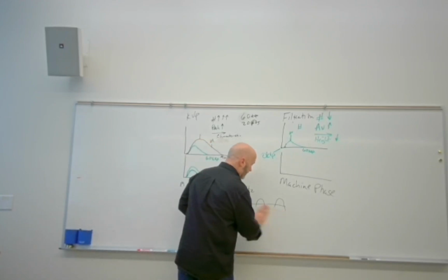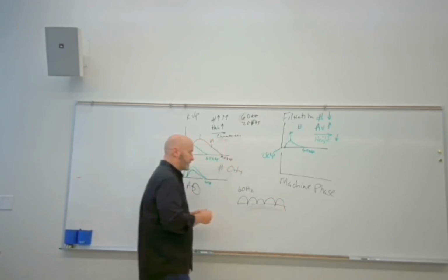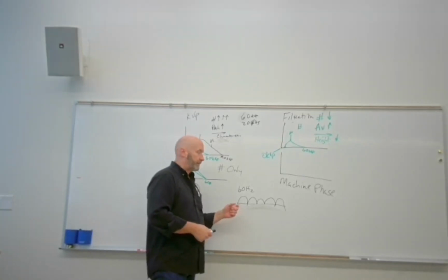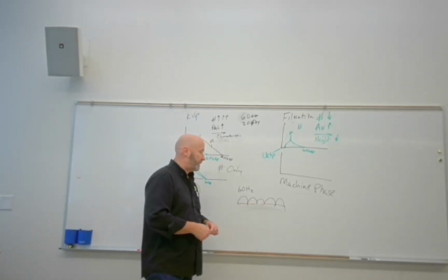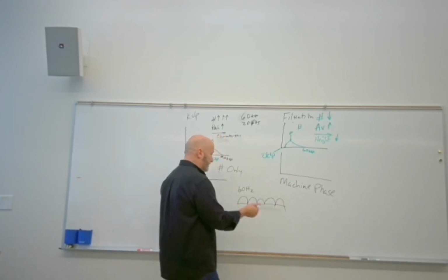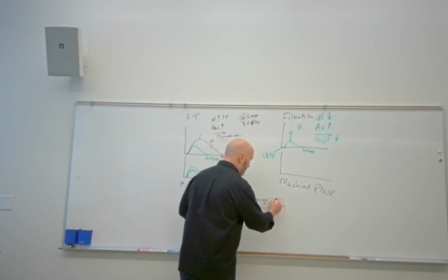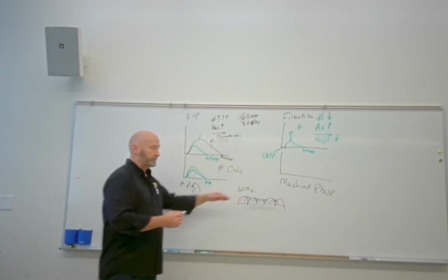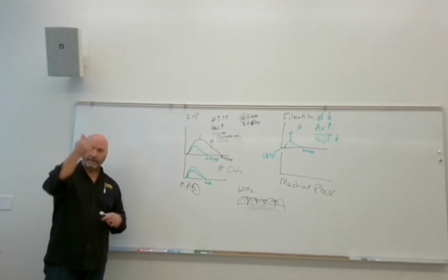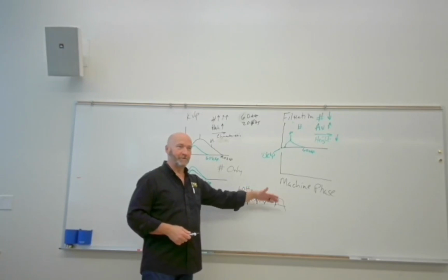So we're going to rectify, and send 2 pulses across. Now we've doubled the output of the X-ray tube. That's still single phase. We still come to a stop every single time. Three phase is where we send 3 different sets of pulses out of sync with each other. So it kind of spackles in that gap. You know what spackle is, right? You got a hole in the wall where you hung a picture, you put the spackle on it, it covers up the hole. Electronic spackle.